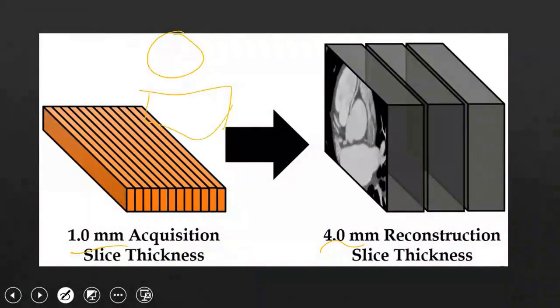Of course, we talked about this partial volume issue that you have with the detector width. This is your specific situation, and there are 2 positions that come in this way, and both positions fall on the same detector width. Consequently, it takes the signal and performs averaging from this position and that position. Therefore, in this case, it cannot discriminate between them.